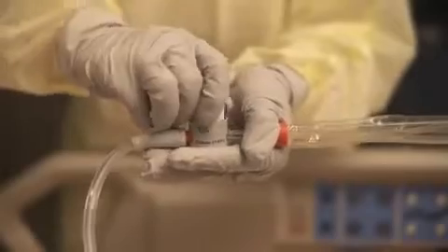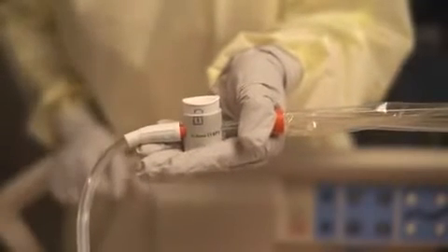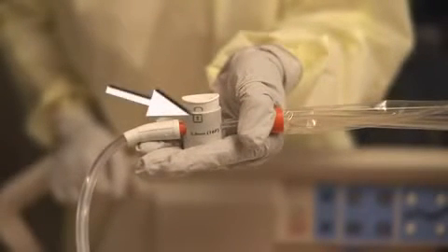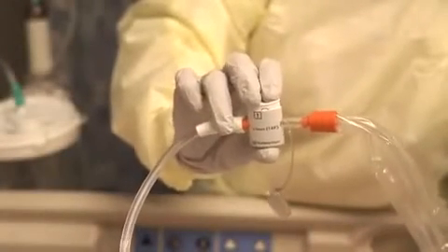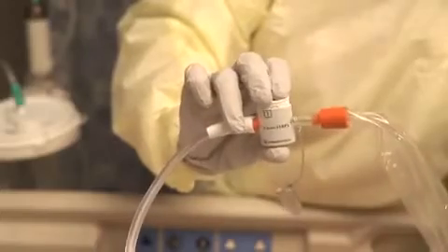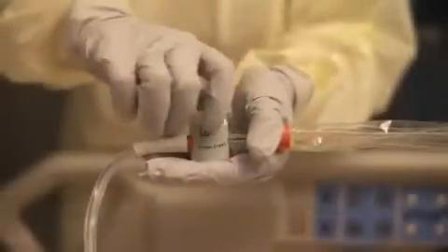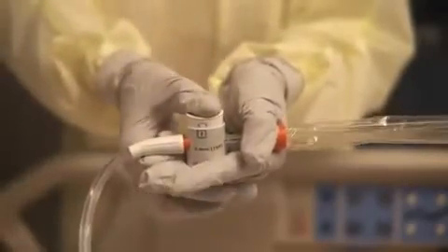Lock the thumb control valve when not suctioning to prevent inadvertent or accidental activation. The lock graphic provides a clear indication that the suctioning thumb valve cannot be depressed. Intermittently depress and release the thumb valve until the catheter and chamber are clear or until the vial is empty. Lock the thumb control valve when not suctioning to prevent inadvertent or accidental activation.